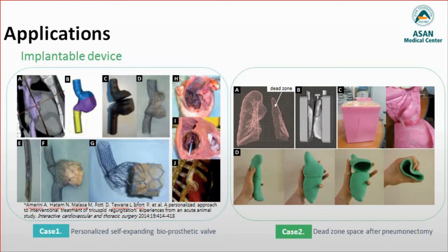In this pilot study, a 3D printer system was used to manufacture the patient-specific phantom of the dead space, which was used as a mold to make a negative mold with silicone material. The final dead space phantom with silicone material was cast by using the negative mold, and the softness of the 3D printed material was evaluated by clinicians.